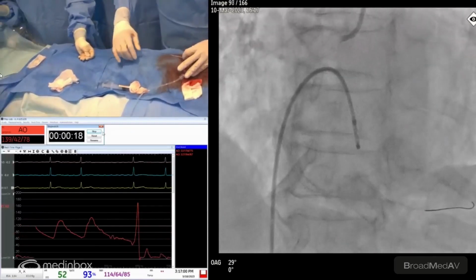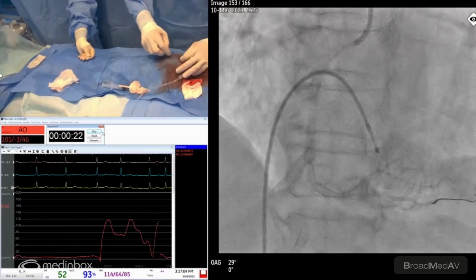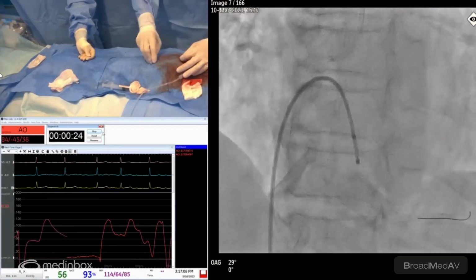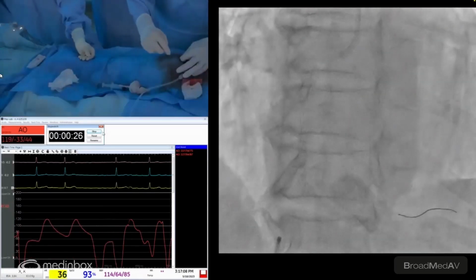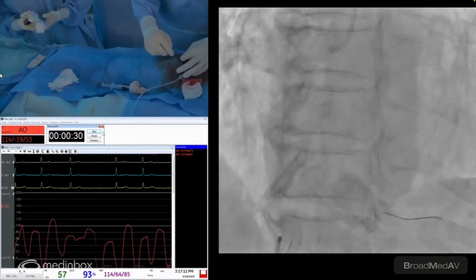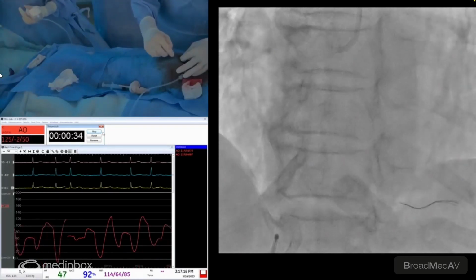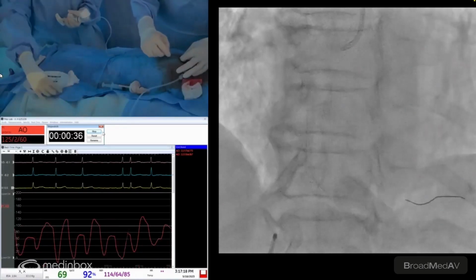Okay, and what do you think for post-dilating in the distal portion? Yeah, I think definitely we're going to do a final IVUS run and decide afterwards. We took that 3.5 to 14 atmospheres, which should take us to maybe 3.6. Definitely a final IVUS run would be very, very informative.